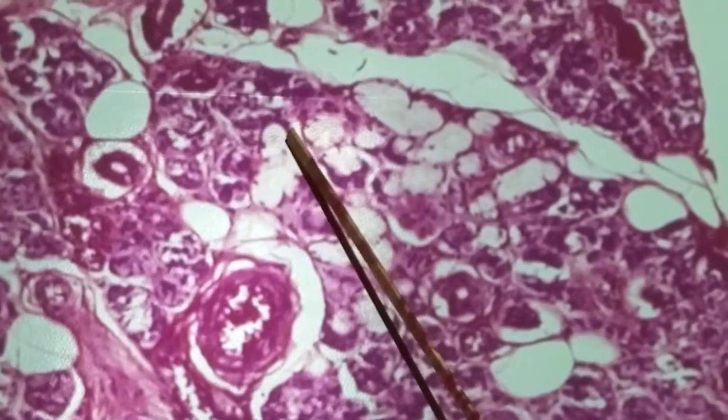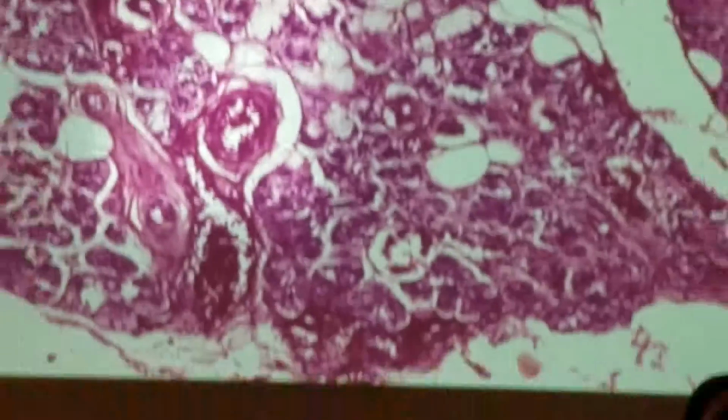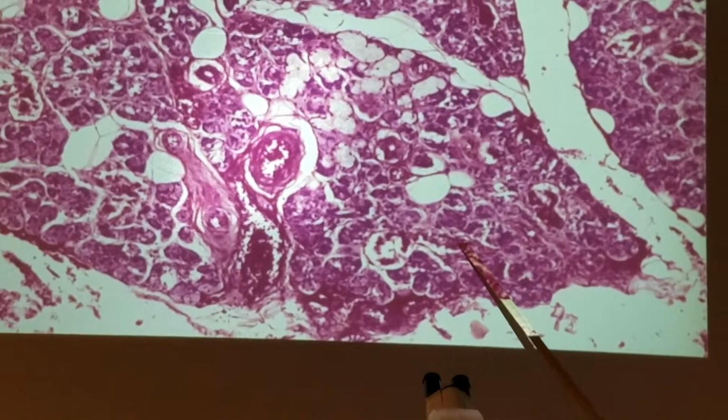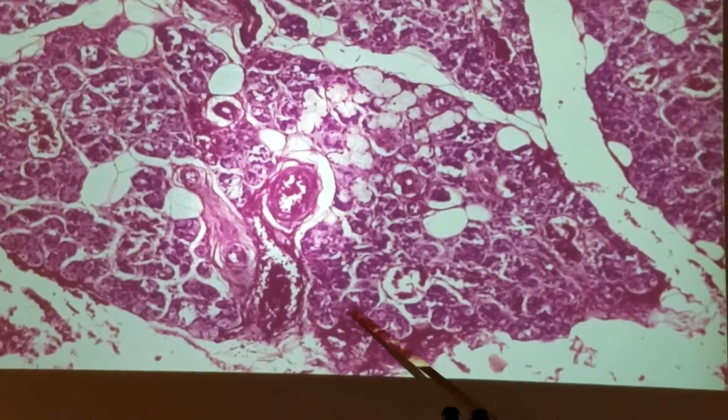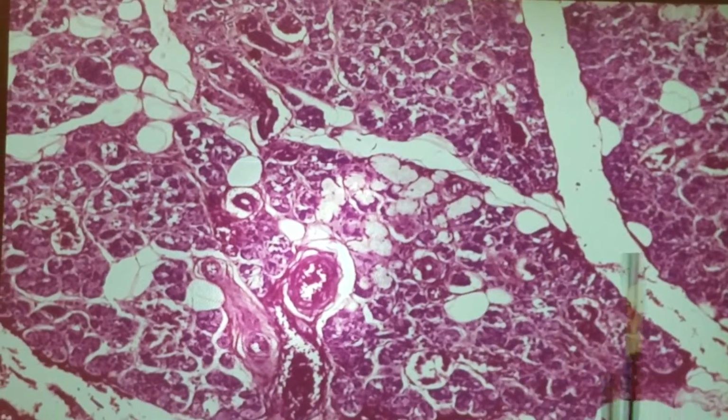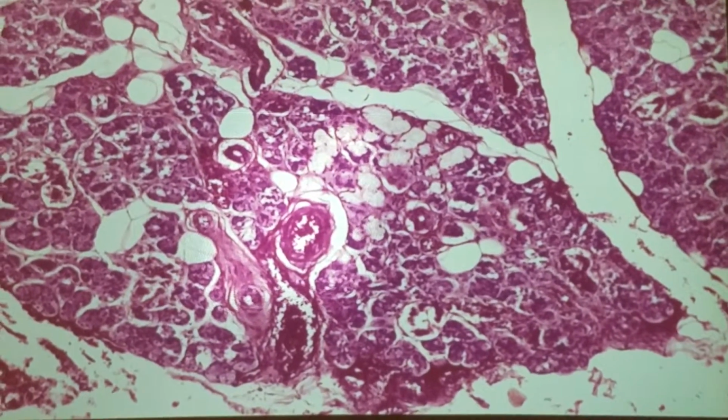All right, the serous acini would be pretty much the whole background of the submandibular. So really, any of these are serous acini cells. Any of these, any of those, all over the place. So it's the whole background. The majority of the submandibular is serous acini.